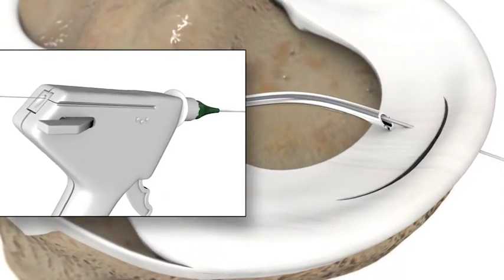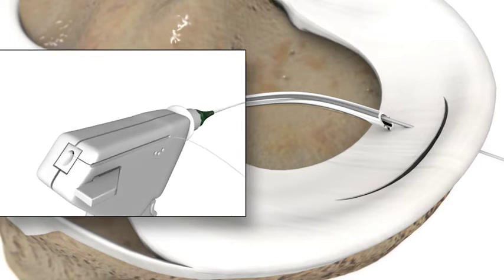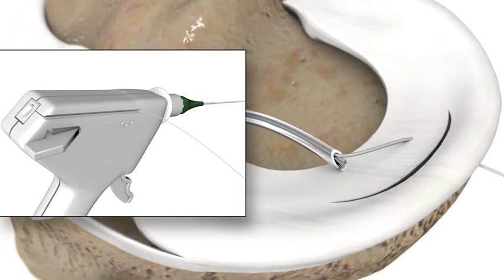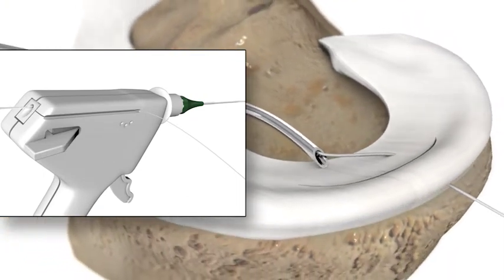Dock the suture off to the right side of the Sharpshooter handle in the horizontal slit. Again, depress the thumb lever on the Sharpshooter handle to insert the needle into the gun.